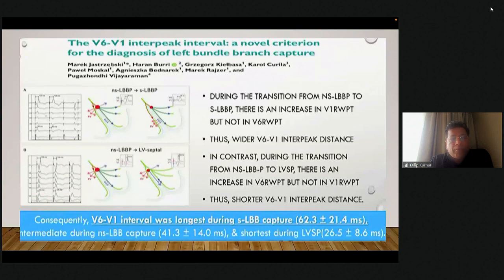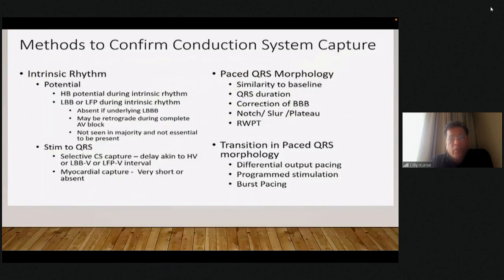And also the V6 V1 interval will be lesser. So I will not go into these deep electrophysiological measurements in detail, but I will give you some evidence. And just before that, just to confirm whether we have hit the conducting system or not.